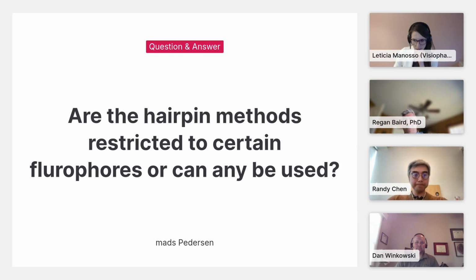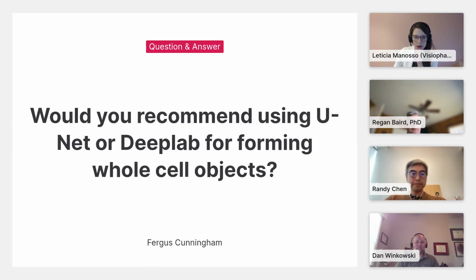All right, thank you. And Fergus is asking, would you recommend using UNet or DeepLab for forming whole cell objects? So in the data that you saw today, I used the UNet network. Just for those of you that we offer a couple different convolutional neural networks in our platform, UNet being one, DeepLab being another. For the applications you saw today, UNet was sufficient for training the network and training the AI to recognize the objects that you saw today.